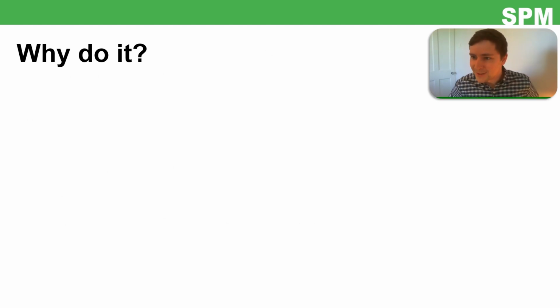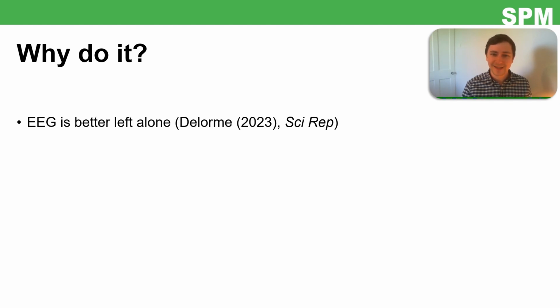And why do it? Some people have suggested that certainly in the case of EEG, good luck with MEG, it could be better to leave the data alone.